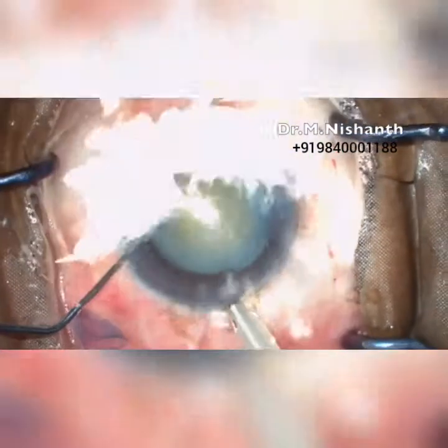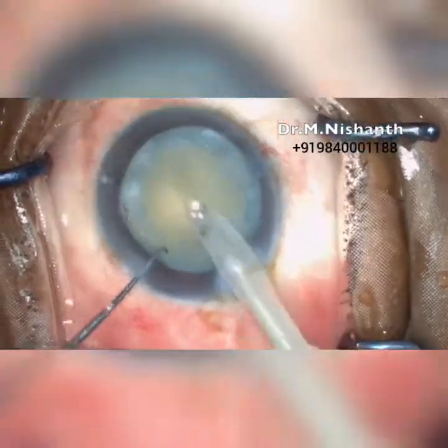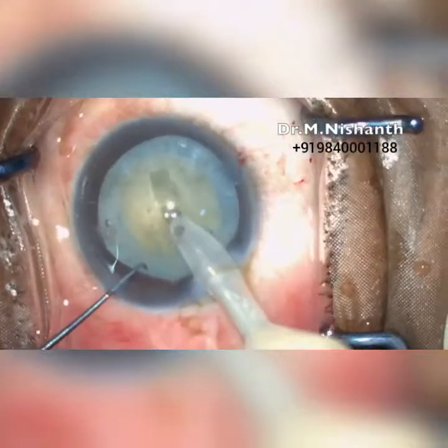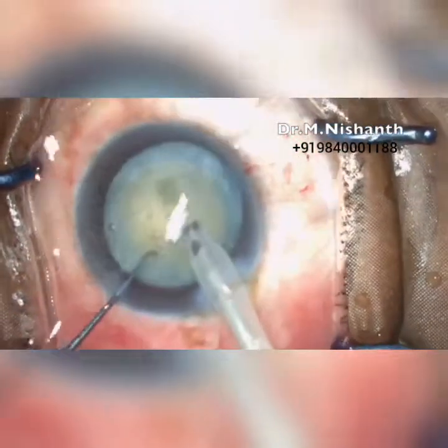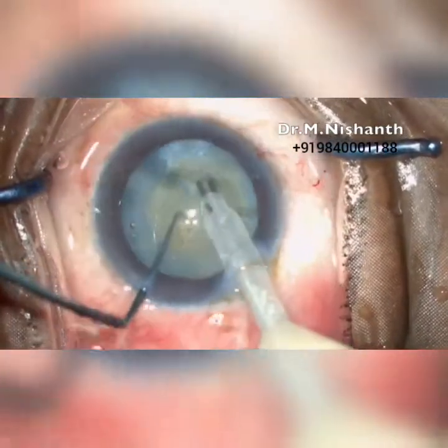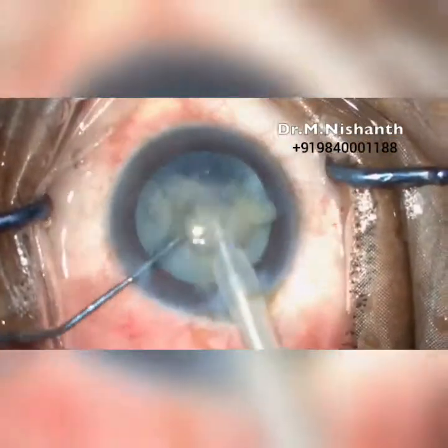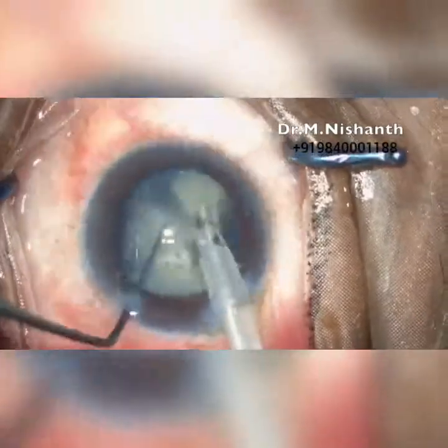Phacoemulsification using the stop-and-chop technique is performed. A long and deep trench is made. The nucleus is divided into two halves, and each half is broken down into smaller pieces and emulsified.